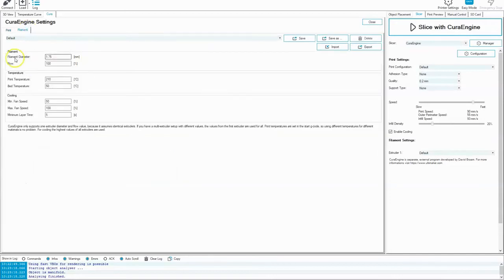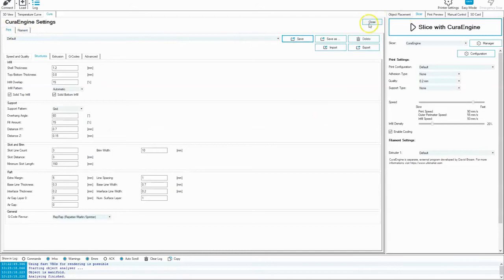Jump into filament. I'm going to look at the diameter. That's all set fine. Flow rate is at 100. Print temperature is 210 and bed temperature is 50, which works great for the PLA that we're running. So we'll hit save at both of these tabs just to make sure they're saved, and then close.